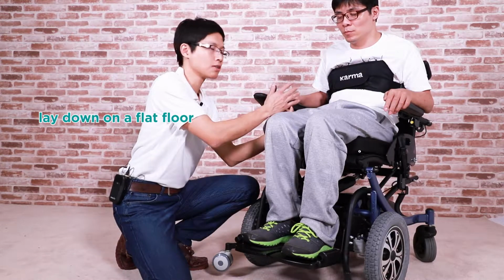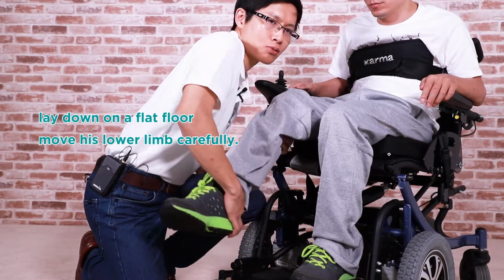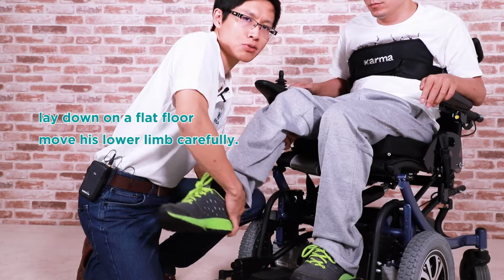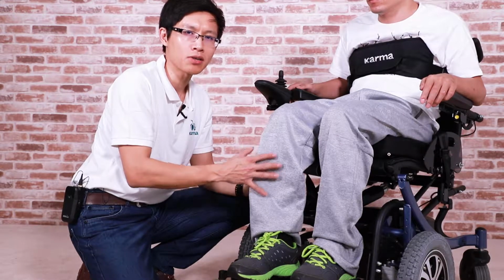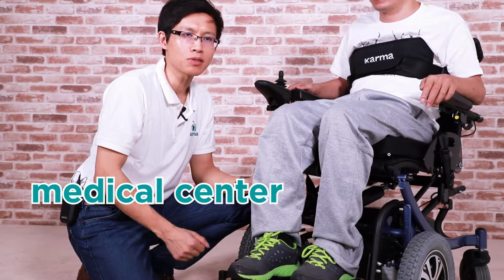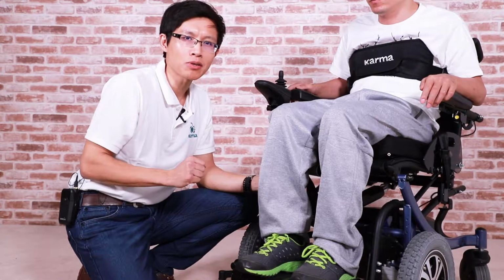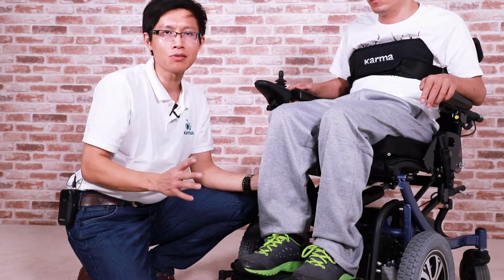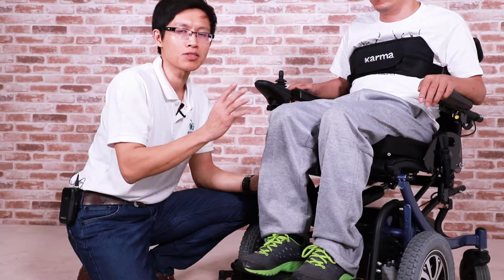Now, how can we self-examine the lower limb function at home? We can ask the user to lie down on a flat floor and help him to move his lower limb carefully. This will allow us to observe if there are any limitations on the leg. We also strongly recommend that the patient go to a medical center to have a thorough checkup from a professional therapist before using a standing wheelchair. Another useful tip to know if someone can use a standing wheelchair is by asking them if they've used any other standing device before.